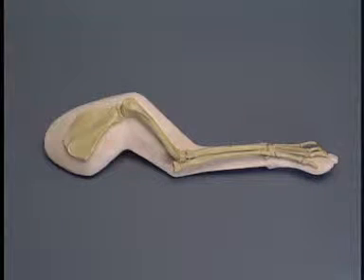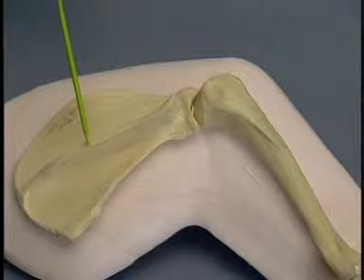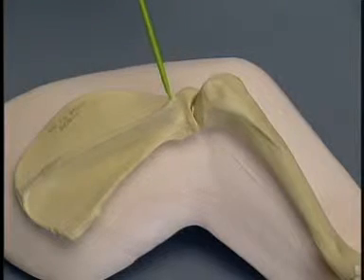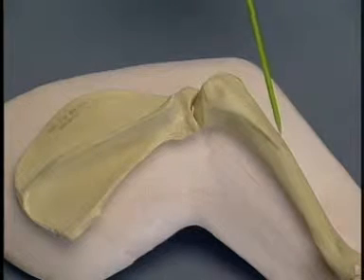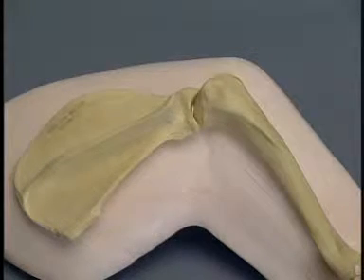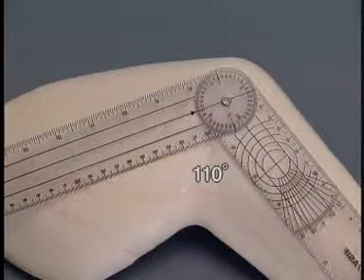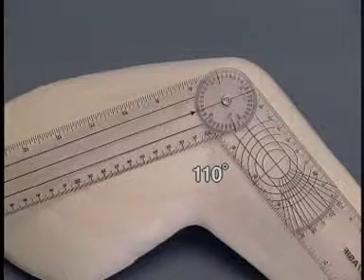The landmarks for the incision are the spine of the scapula, the acromial process, the greater tubercle and the proximal diaphysis of the humerus. The angle for the shoulder arthrodesis is predetermined by observing the normal standing angle of the shoulder in the individual patient. Commonly, the angle is 110 degrees.